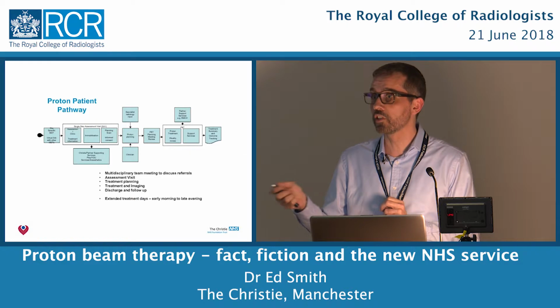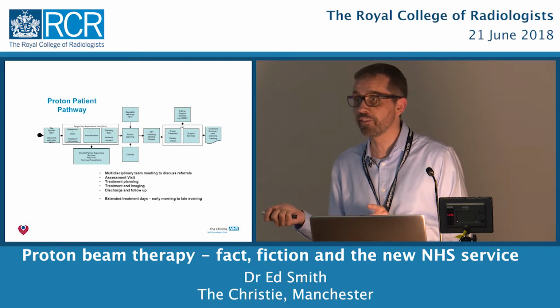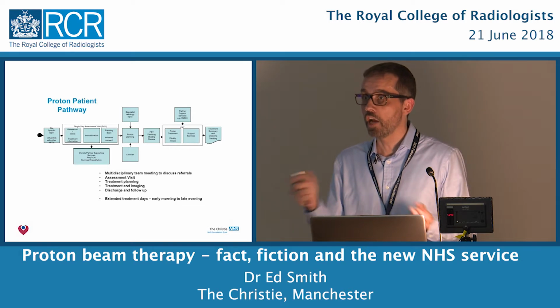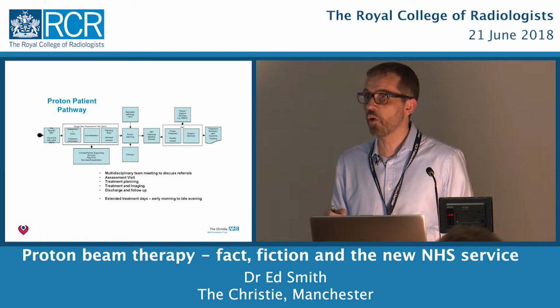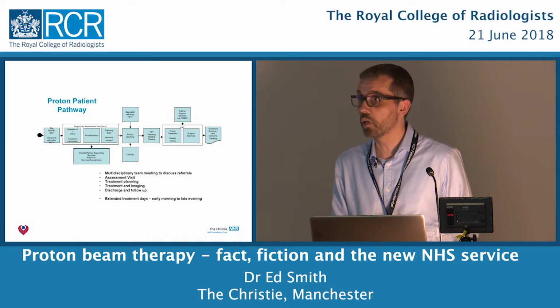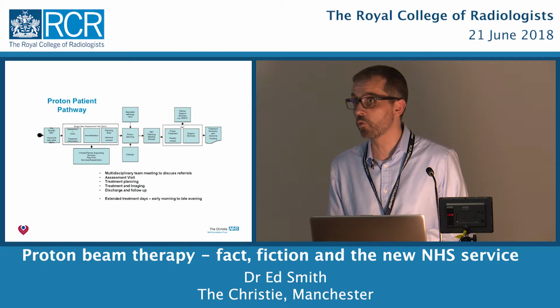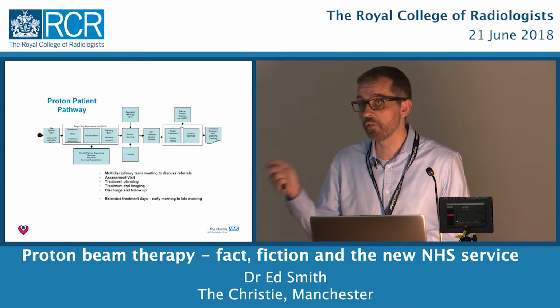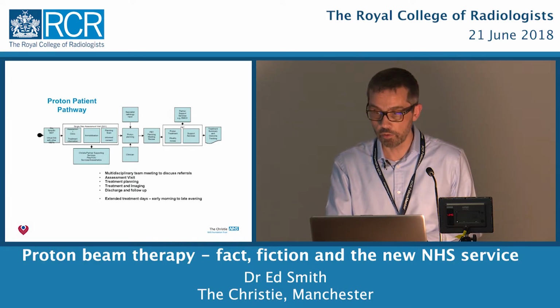You notice there is one cyclotron. Cyclotrons are very expensive. So that's why you've got one cyclotron servicing 4 rooms. And you actually have to wait for the beam in each room. Now actually, because the treatment times are so short, you can request the beam and you actually get that in a matter of minutes, mostly. But the researchers need to have continuous access to the beam, and they will tend to do that in the early hours of the morning and at the weekends. Occasionally, if we have issues with the service, we may treat at the weekends.